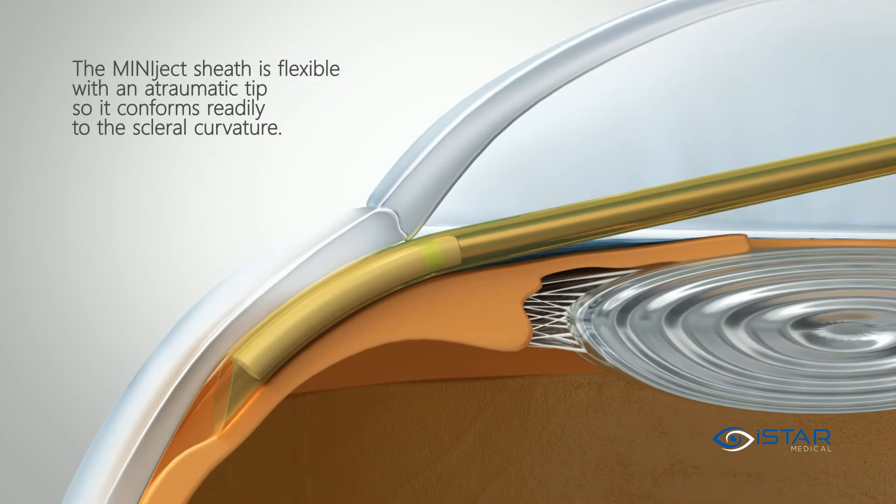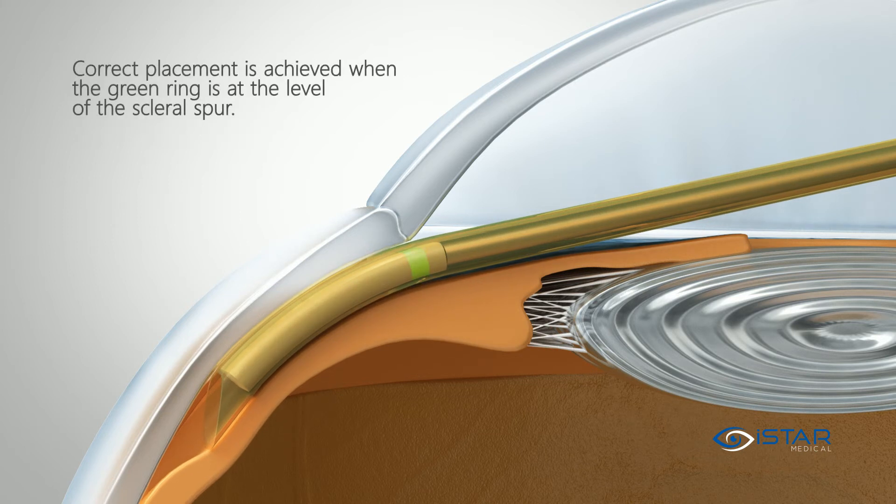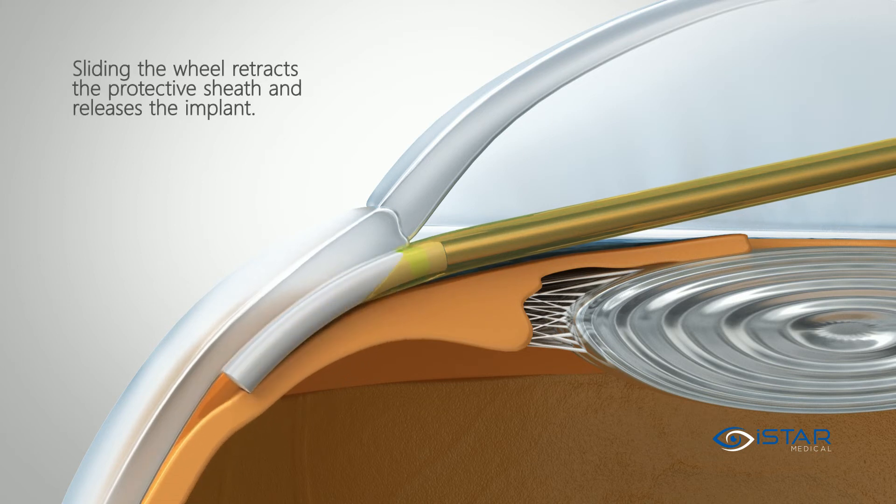The Miniject sheath is flexible with an atraumatic tip so it conforms readily to the scleral curvature. Correct placement is achieved when the green ring is at the level of the scleral spur. Sliding the wheel retracts the protective sheath and releases the implant.